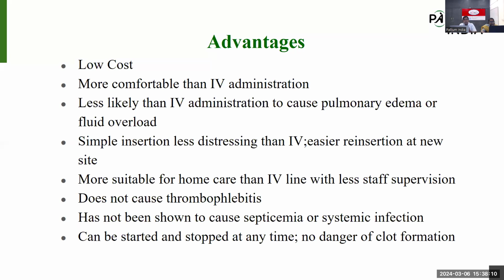Then it is less likely than IV administration to cause pulmonary edema or fluid overload. In IV administration, there is a chance of administering more fluids, but in subcutaneous infusion, we have a limit. We can choose a maximum of 2 sites for subcutaneous infusion for a patient in one day, and the total volume of administration is 3 liters over 24 hours. So there is less chance of development of pulmonary edema and fluid overload. Then simple insertion, less distressing than IV, and easier reinsertion at a new site.